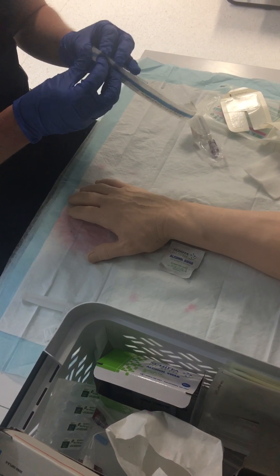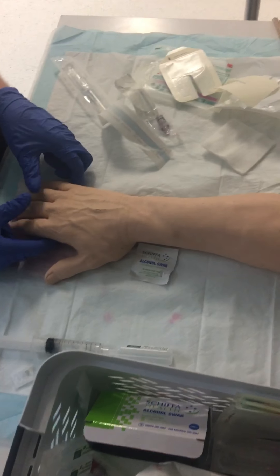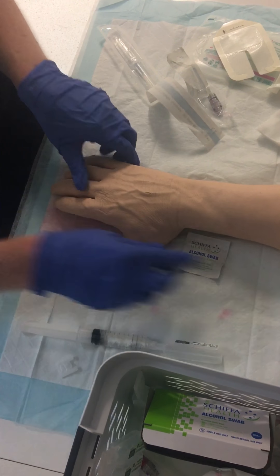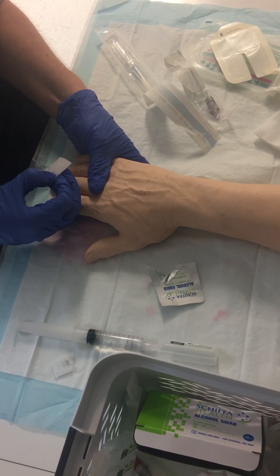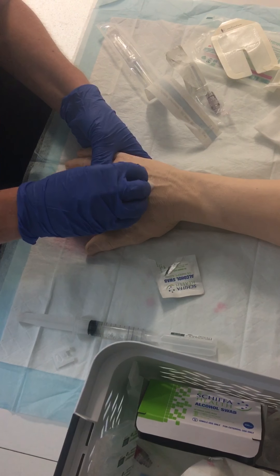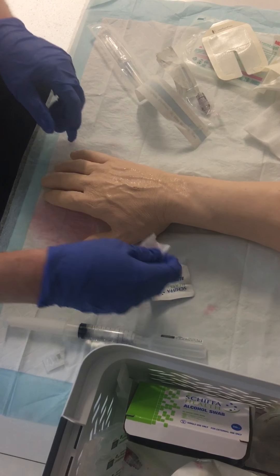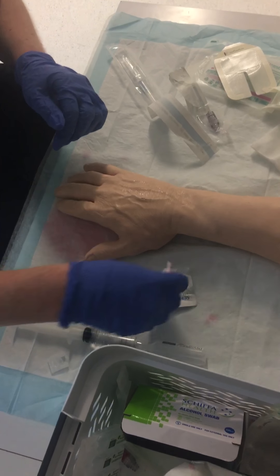I'm going to firstly look for which vein I want to use. I can do that by stretching down the patient's hand and having a bit of a look. I'm going to try to find the straightest vein — in this case it would be this one here. Then I'm going to clean the site, going in small circular motions and working my way outwards. If that was dirty, I would use another swab and go back again to clean that area.